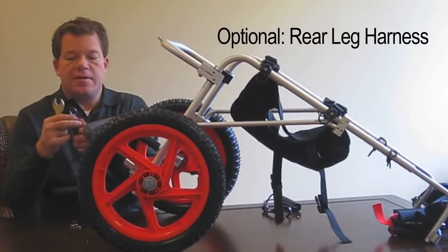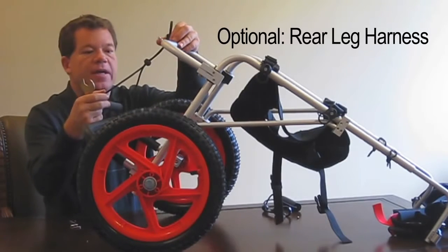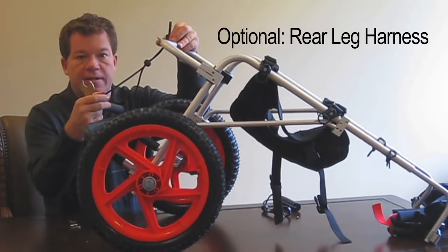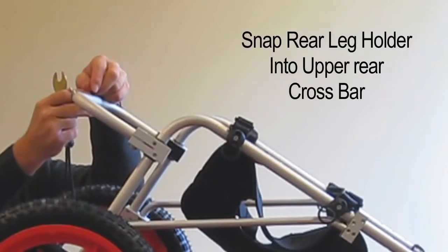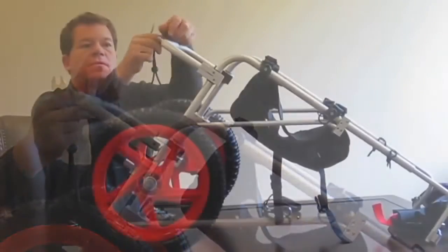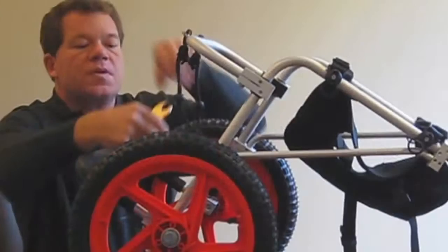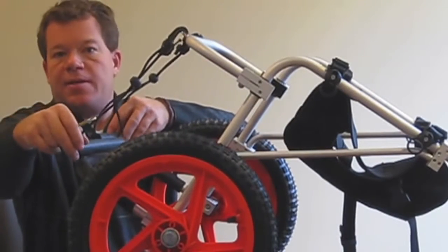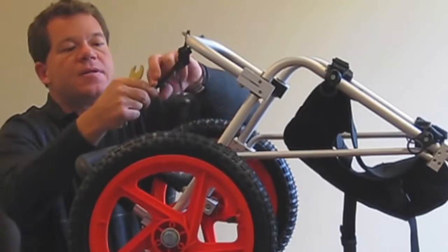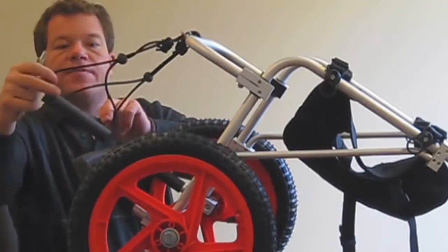This is optional — the hind leg holders. This is for a pet that doesn't have use of their hind legs at all. These snap onto each one of the upper rear crossbar connections, just like so. This is for the dog's back legs if they don't have use of them. This is also adjustable so you can move it up or down to adjust it for your pet.